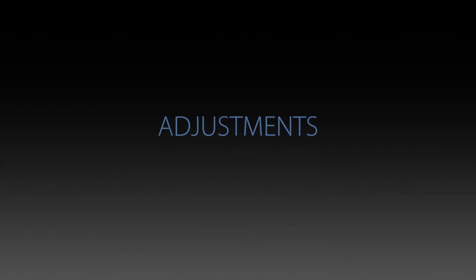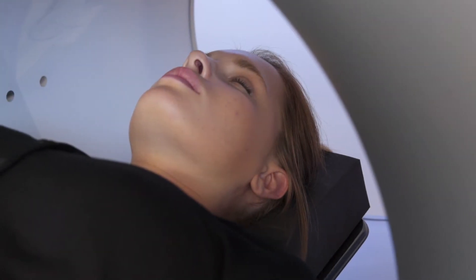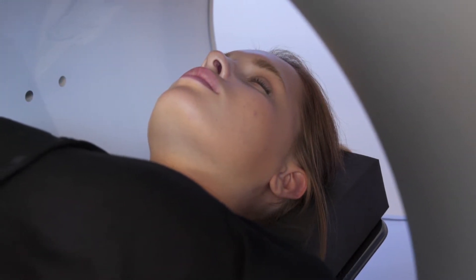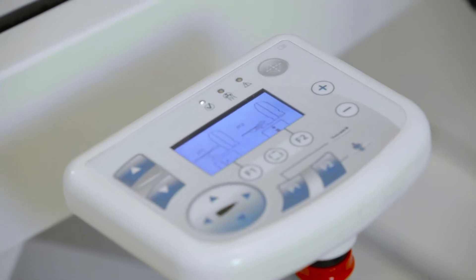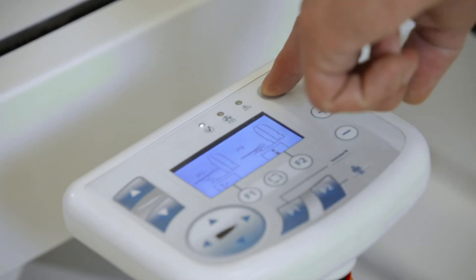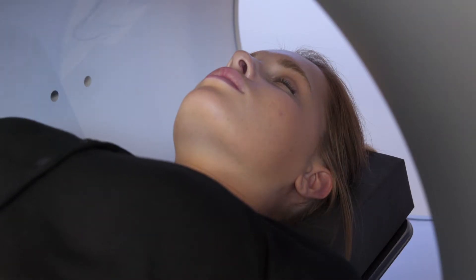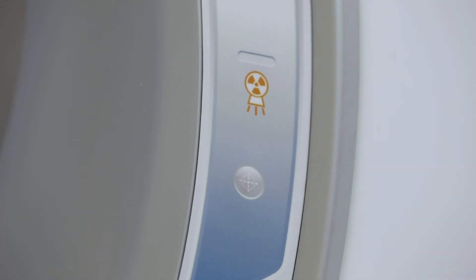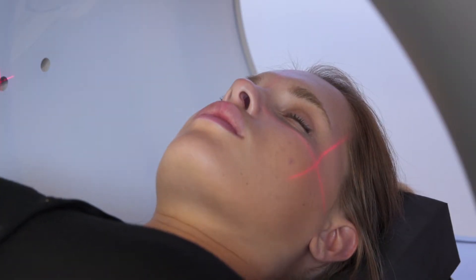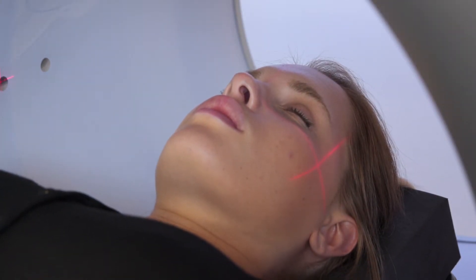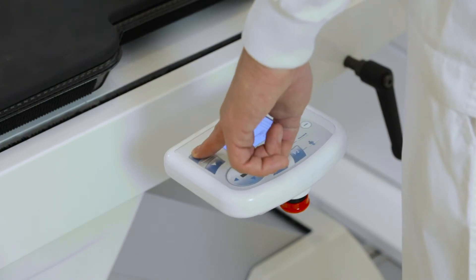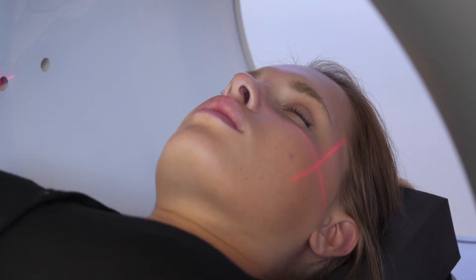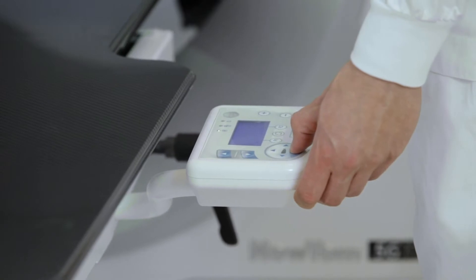For precision adjustments, the laser centering device can be used. To activate it, press the laser key on the control console. It is necessary to have started the NNT software or use the keypads on the sides of the scanning unit. Perform a fine adjustment of the patient's position using the movement control keys: up, down, left, right.